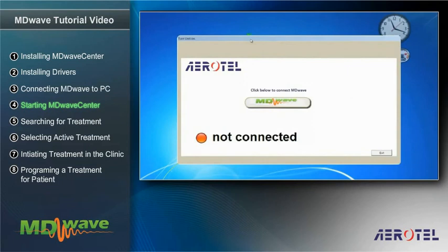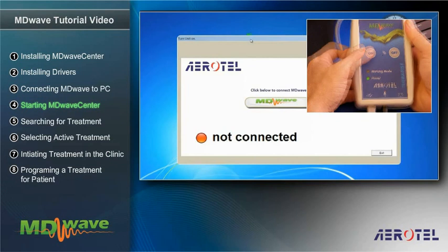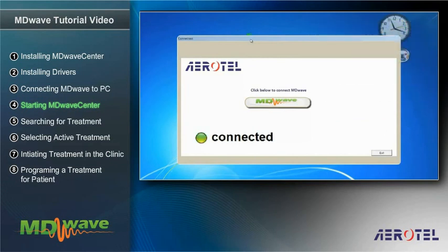In the window for connecting the program to the MDWave device, a red, not connected announcement will appear. Now, turn on the MDWave device and check that the previously red announcement in the connection window has become a green, connected announcement.